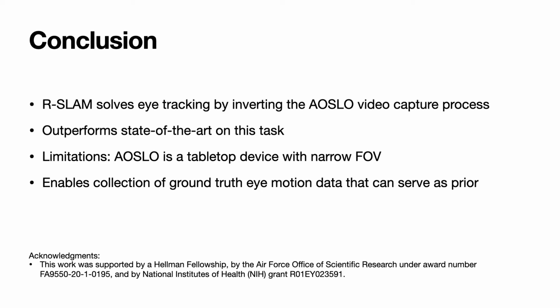To conclude, RSLAM solves for eye motion by inverting the AOSLO video capture process using optimization. Our novel Convex Initialization and gradient-based refinement algorithm outperforms prior work in this area. However, it's important to note that the AOSLO has limitations. It's a tabletop device rather than a head-mounted display, and can only image a narrow field of view unlike other tracking systems. Nevertheless, the AOSLO combined with RSLAM form a computational imaging system offering the most accurate eye tracker in existence, enabling the collection of ground truth eye motion data that can be used as priors in other less precise tracking systems, and more broadly in the field of computer vision.